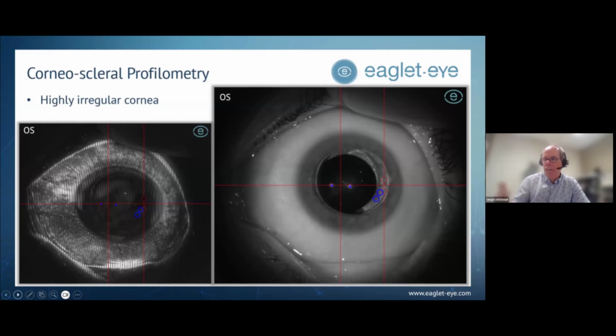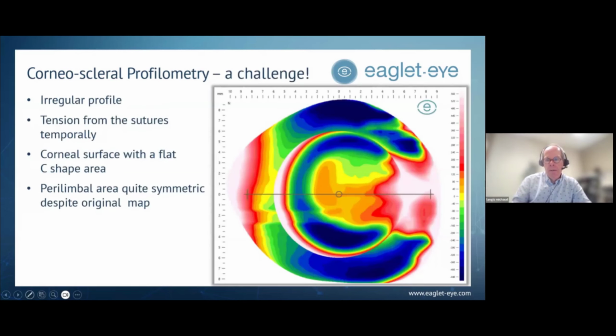If it's not the case, I just retake a second one, a third one, and it's quite easy to do so because you have a button to save and take another image, so it's very, very fast. The eye held open like this evaporates quite rapidly, and sometimes if the fluorescein is not that present, this is when your images are not of good quality.